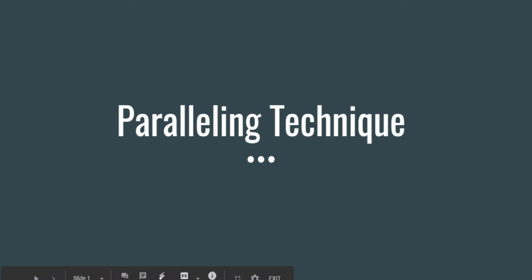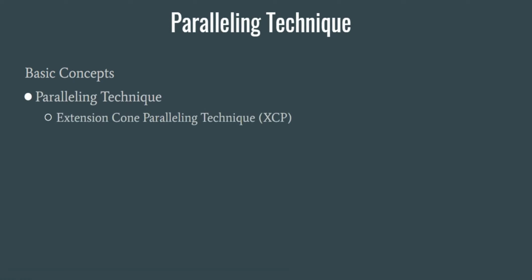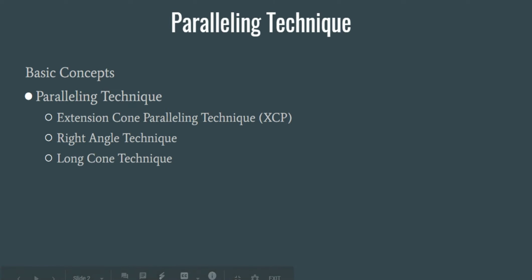So let's get started with the basic concepts of the paralleling technique. This technique is also known as the extension cone paralleling technique, or XCP, the right angle technique, or the long cone technique. And there's a few basic terms that we need to discuss before we move on to help you understand the paralleling technique a little better.